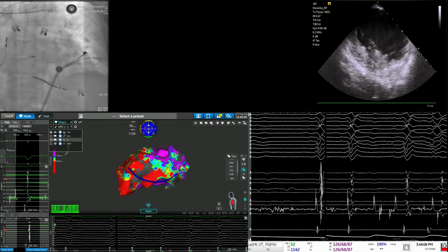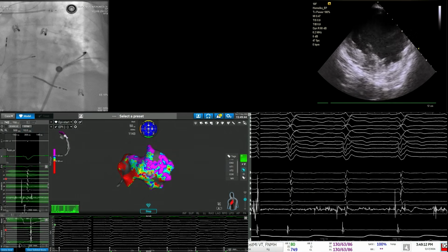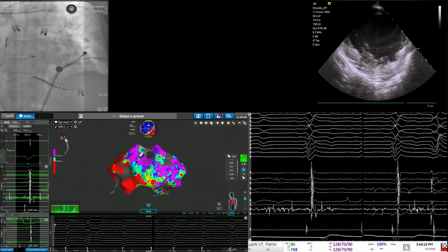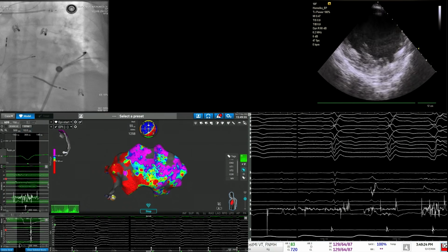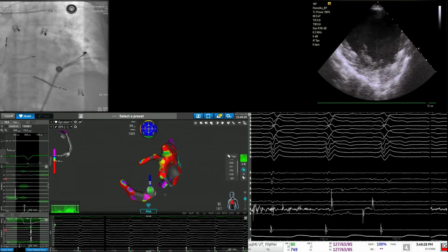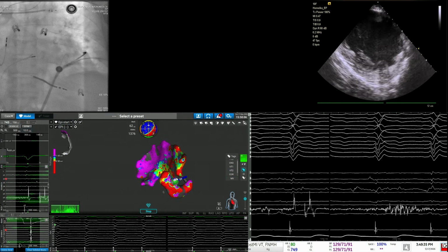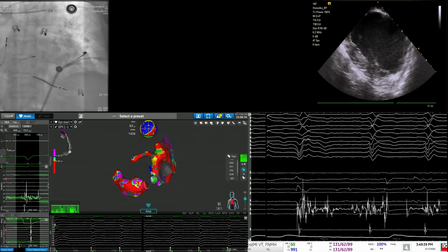When you're mapping in the epicardium with the Affera, have you instilled any saline to give you more space? Excellent points. Yeah, two points. Number one, we mapped the endocardium first. When you take the catheter out, one of the things people have described is the potential for tissue on the catheter. So we watch the catheter, even when we do endocardial, to make sure that it looks okay before putting it in the epicardium. Of course, the bigger concern is going the opposite direction. Once we finish epi mapping, make sure there's no fat on it. That'll be a problem going endocardial.